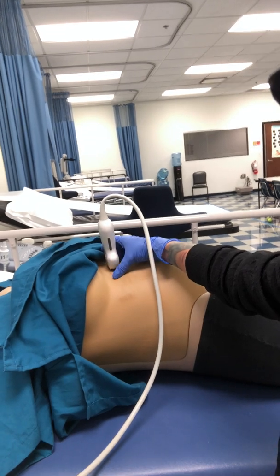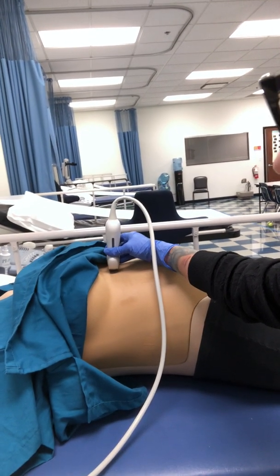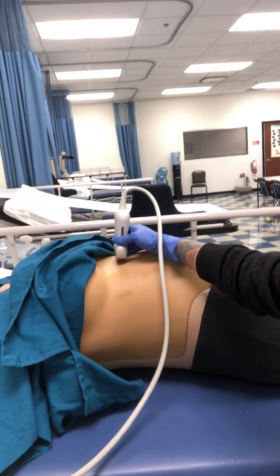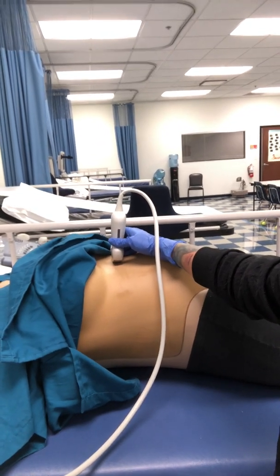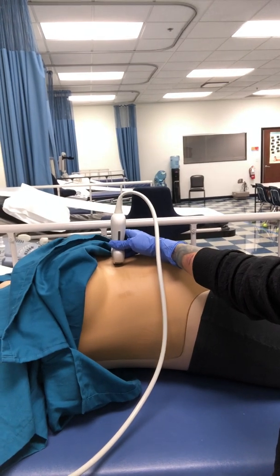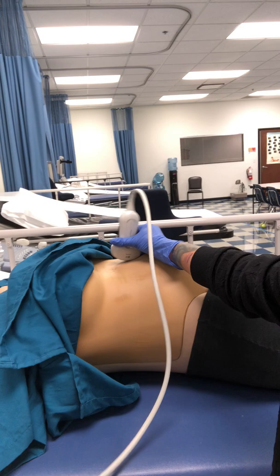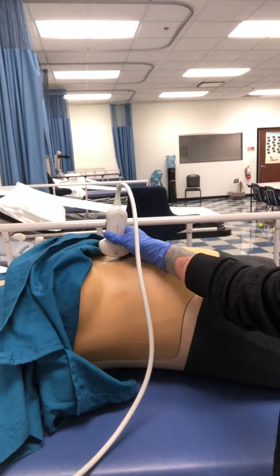You can see right, and then you can see left on the opposite side, but you would have to physically move superior or inferior in order to see structures outside of the area you're particularly scanning. So if you're in transverse, you cannot see superior or inferior unless you physically move. If you are in sagittal, you cannot see right or left unless you physically move the probe.